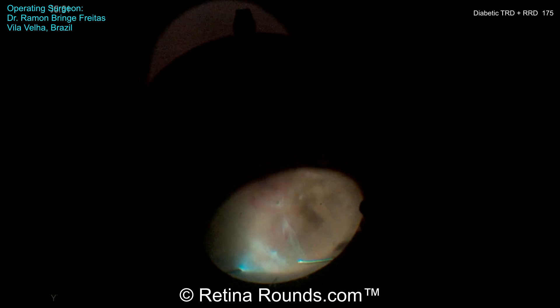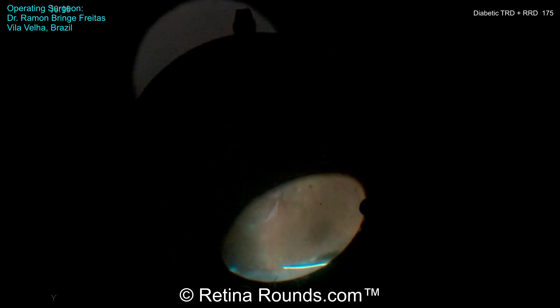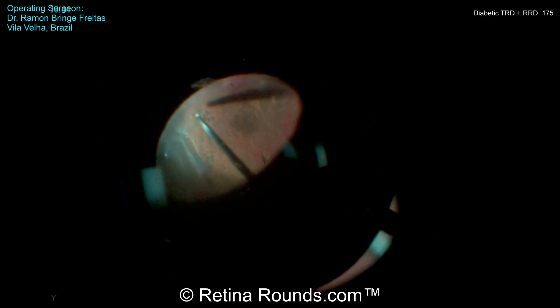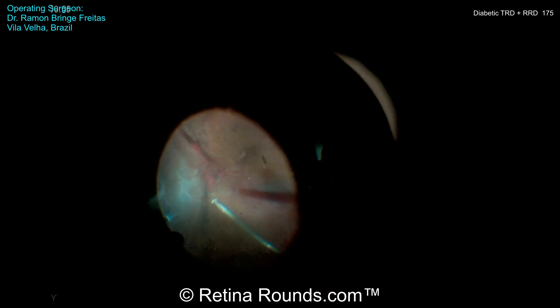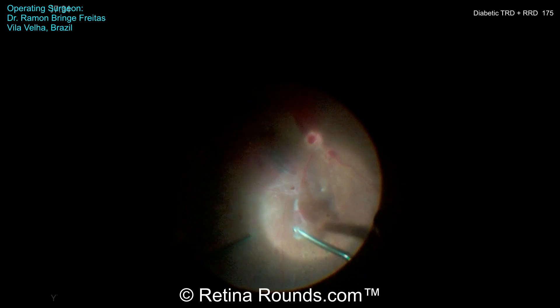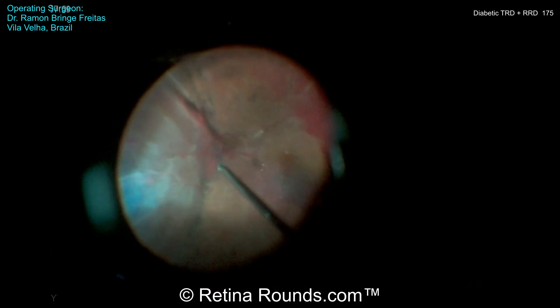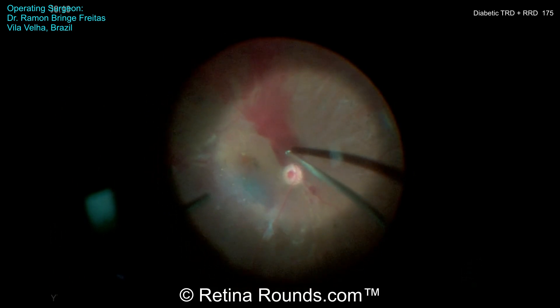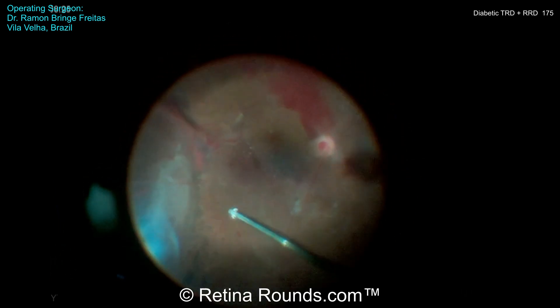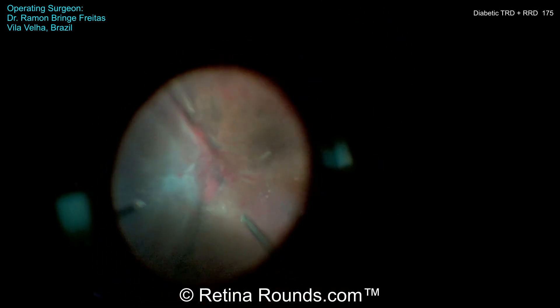In the superior quadrant, some vitreous hemorrhage is being removed. There's a fibrovascular membrane or stalk present along the supratemporal arcade with an associated posterior retinal break. He's trimming back some of the peripheral vitreous nasally and now inferiorly. The vitreous has not yet been elevated over the posterior pole and over this temporal area of more bullous retinal detachment. More peripherally, there appears to be a retinal break, and he's trimming vitreous adhesions off of that break. He's now trimming back this fibrovascular stalk and aspirating over the optic nerve to try to elevate the hyaloid over the macula, but you can see some submacular hemorrhage is coming out through that posterior break. He's aspirating to try to engage the posterior hyaloid, particularly over the macula, and propagate the PVD more temporally, removing vitreous adhesions in this more bullously detached temporal retina.